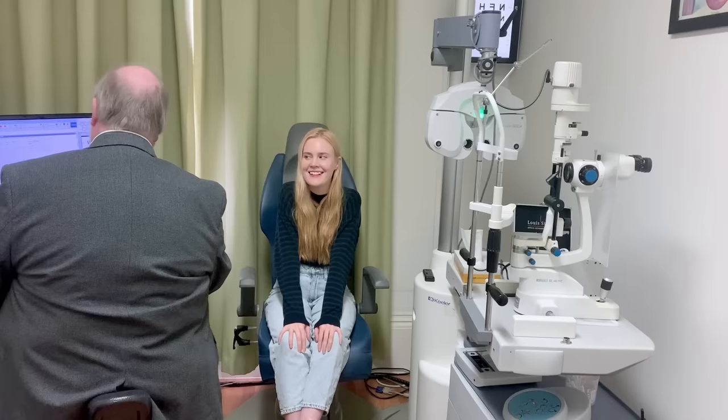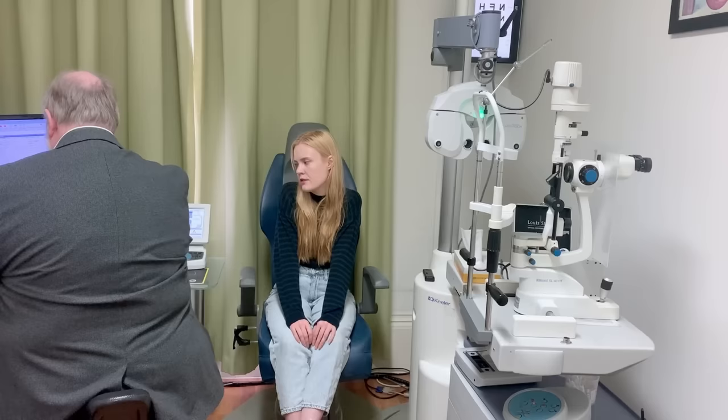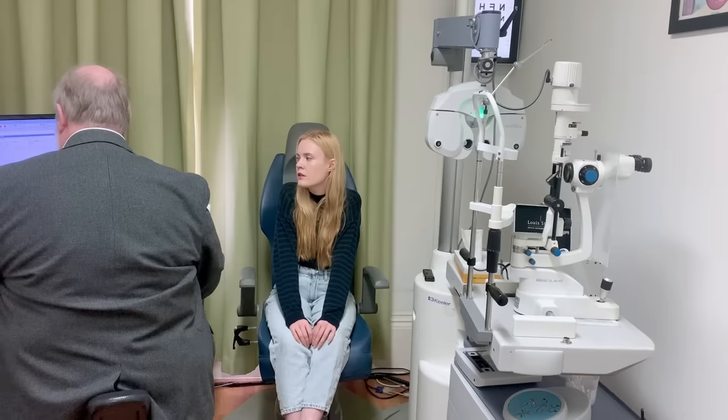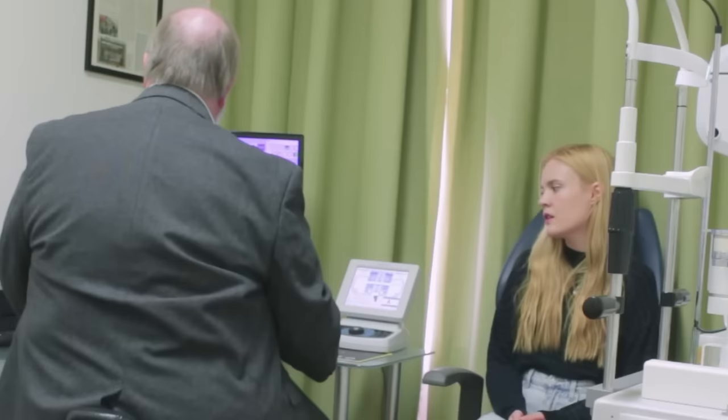But any diabetics or glaucomas in the family? Yes. Who's diabetic? My gran and my aunt. Okay. They get that later in life, do you know? Yes, quite recently, I think. Just over 50 my aunt got it. It tends to be a later life thing, unfortunately. Okay, no cataracts or anything like that?